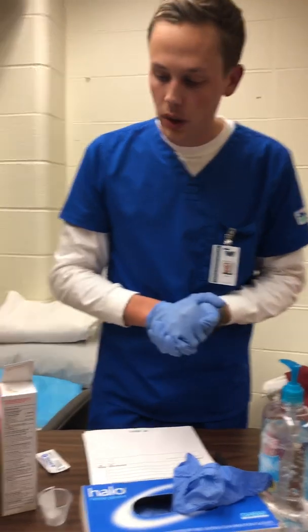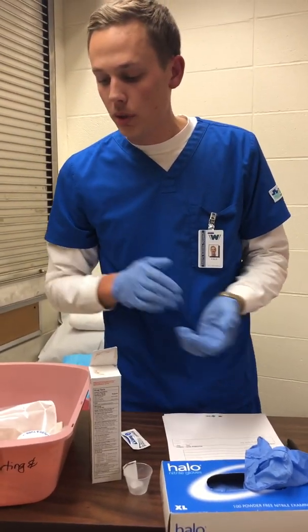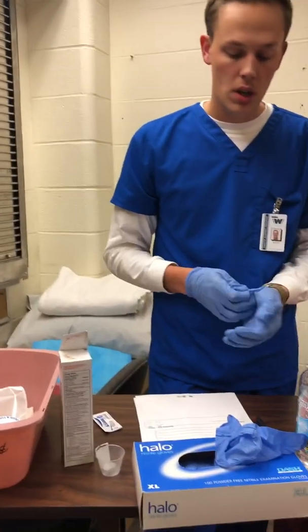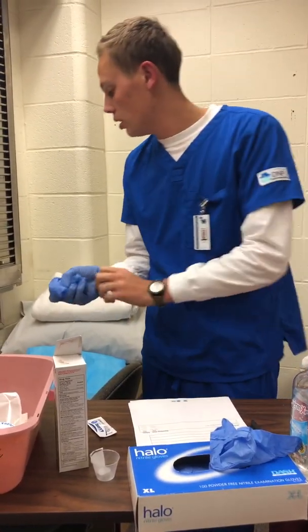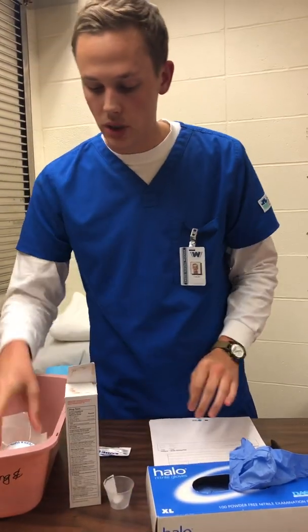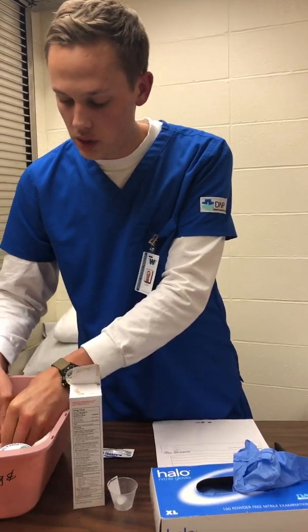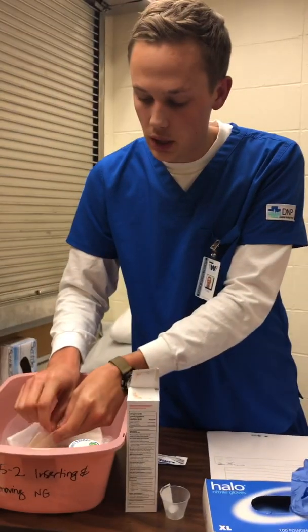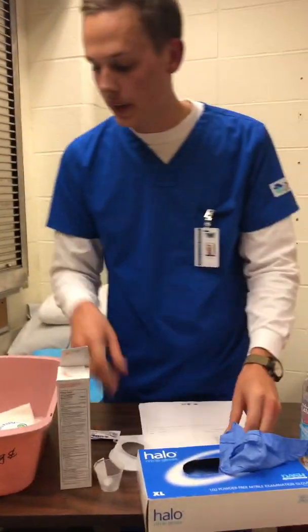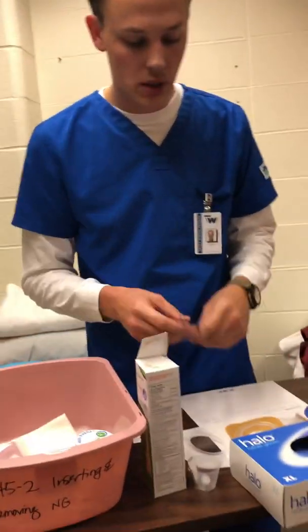And then lastly, we're going to be doing the ostomy care. So before I head in, I want to make sure that I have everything that I'm going to be needing. I'm in the med room, and before going in, I'm going to make sure I have everything that I need. So when I go into the patient room, I'm going to be needing a new ostomy bag with a clip. I'll be needing a new faceplate. I'll be needing scissors to cut the faceplate.